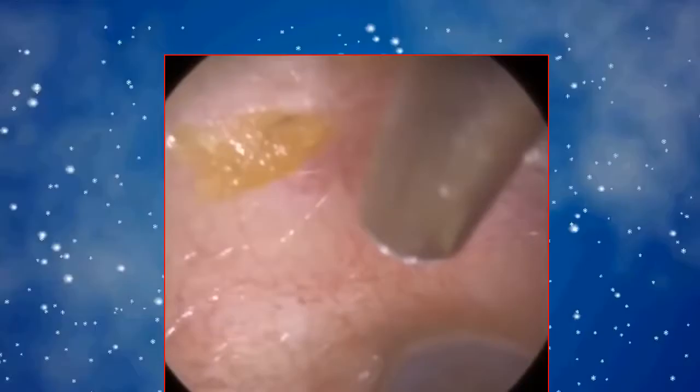Let's see if that improves the patient's symptoms. The patient did get back to me actually and said that since I removed that piece of skin on the eardrum, it has improved their occlusion at night. For some patients it wouldn't have, because it's only a minimal amount, but fortunately for this patient it's done the trick. And I'm now just mopping up around the edge, but to be able to remove that off the eardrum with the eye clear scope, you can see how the view it offered.